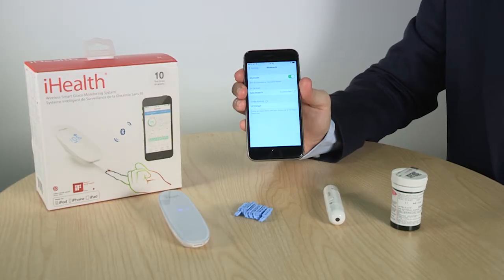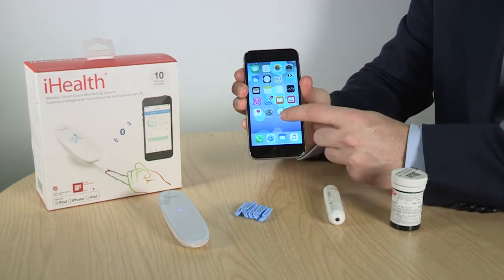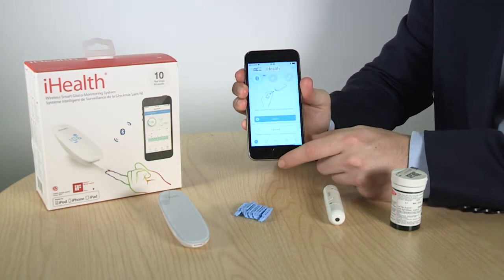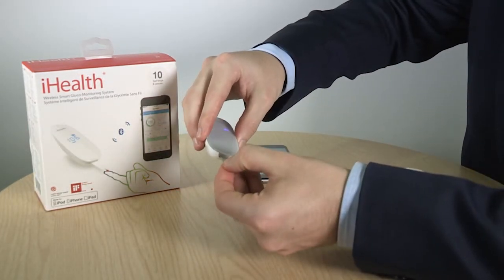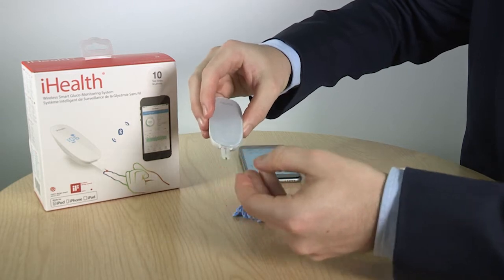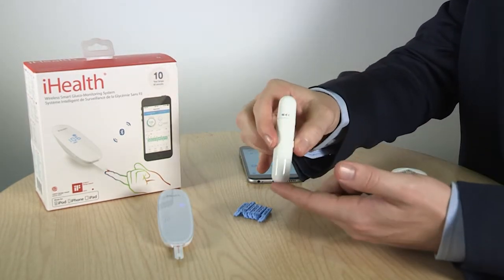All you need to do is pair the device with your phone, open the free iHealth app, insert your test strip, and use the provided lancing device to take your sample.